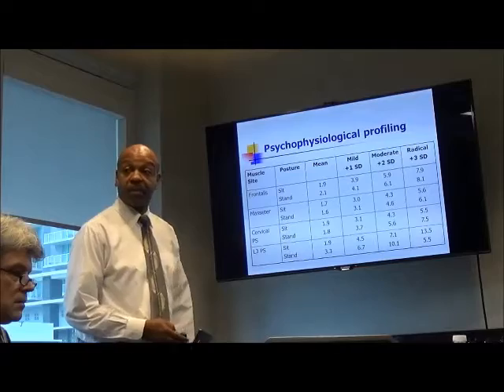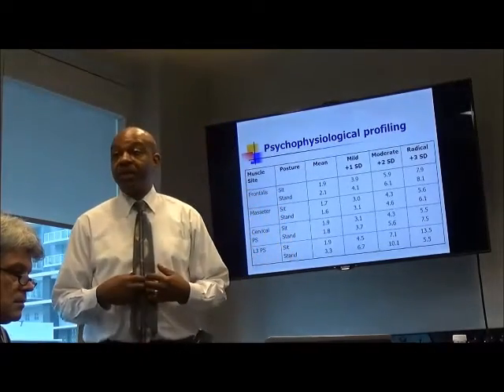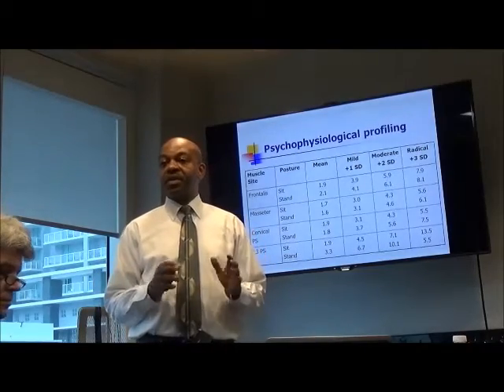Do you usually do that? Do you have the patient sitting? For me, when I do a stress assessment, it's all sitting.